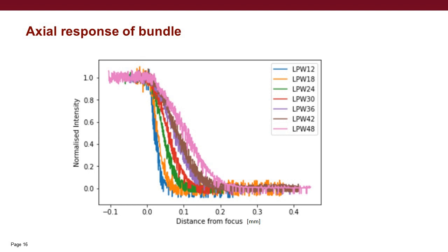Those aren't really useful quantities to know, as it's system dependent, because we are not reporting values in real space. But what you can see from this plot is that LPW 12, a line pair width of 12, meaning 6 black pixels and 6 white pixels, or 6 on, 6 off, is going to drop off a lot quicker. So if you want more well-resolved fibers, LPW 12 is going to be able to reconstruct everything in contact with the probe, and everything further back will be attenuated.